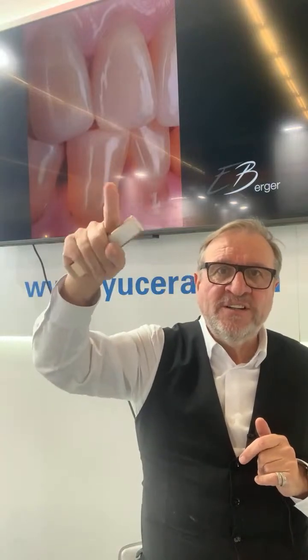It's not possible. This is the final result between the original piece and now the result for our crown, made only step by step, choosing the right color, choosing the right material, the right size, minimum thickness of that material, and then glaze or veneering to have such a result.